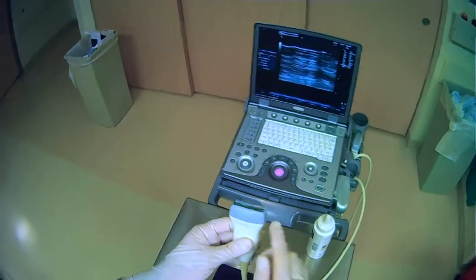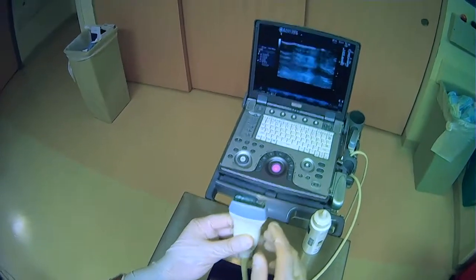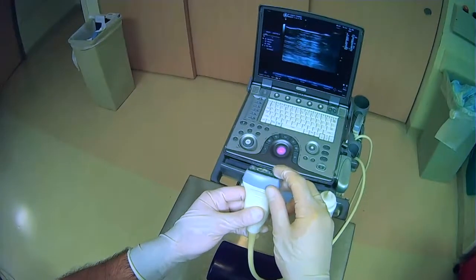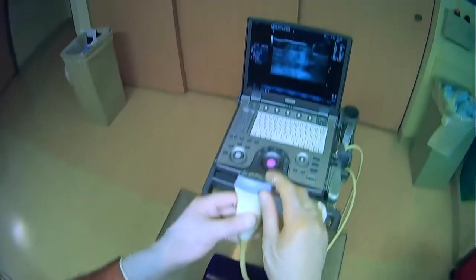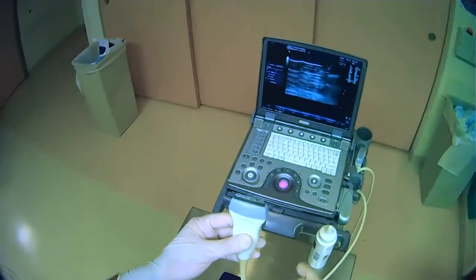Anytime you grab a probe, there can be markings on the side that you may be familiar with that answer this question, but it can also be very useful to just put your finger on one side and tap. We can see that the right side of the probe here, as I tap, corresponds to the right side of the screen over there.